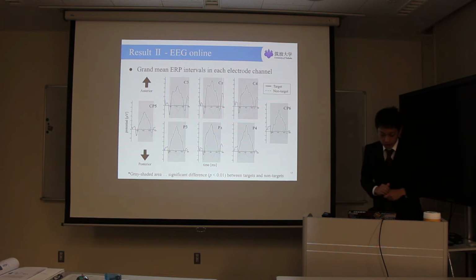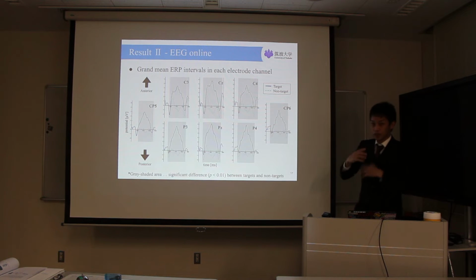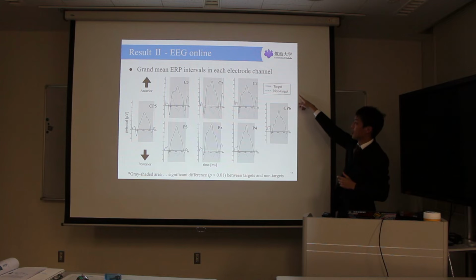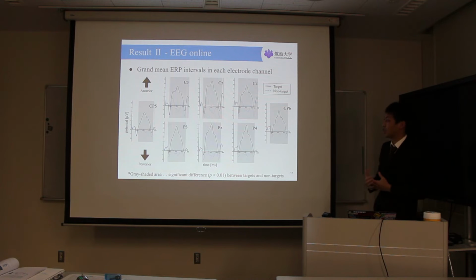So in each electrode channel, we could confirm strong P300 responses only when the target stimulus is given to each user.